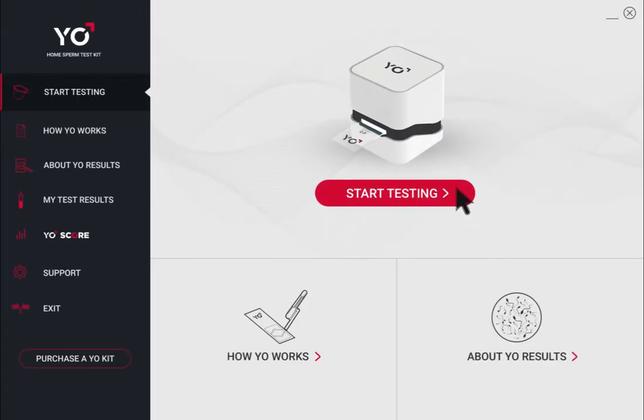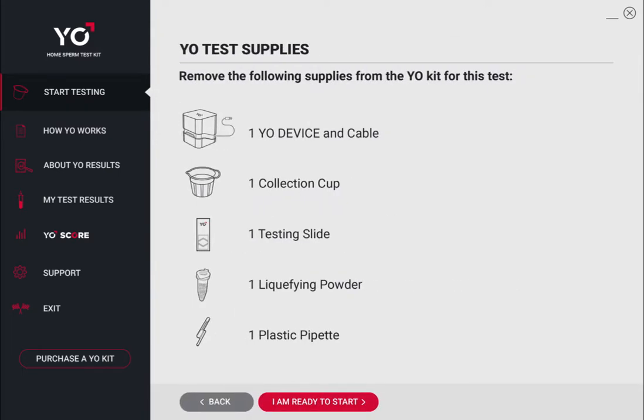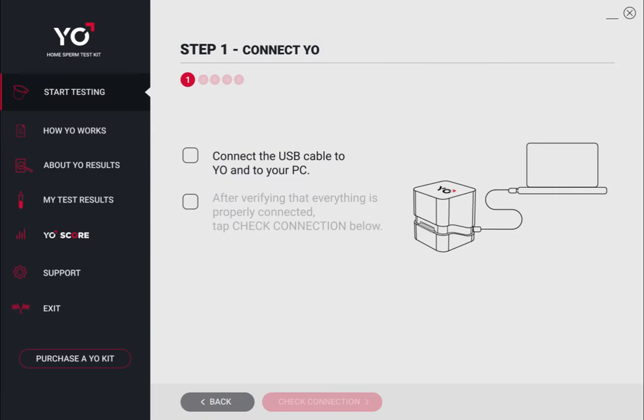Click Start Testing to begin. Place the supplies for one test in front of you. Connect Yo to your computer using the supplied cable, then click Check Connection.